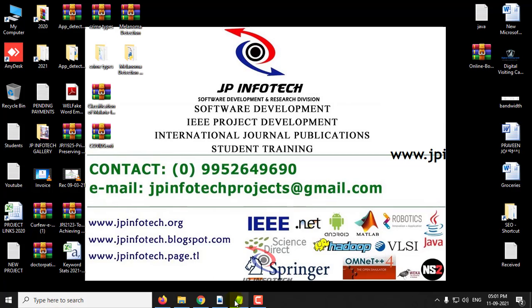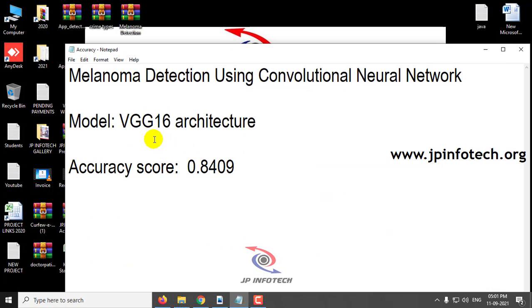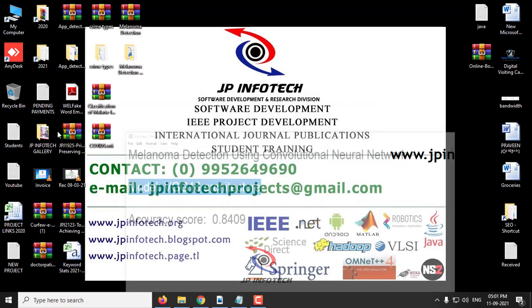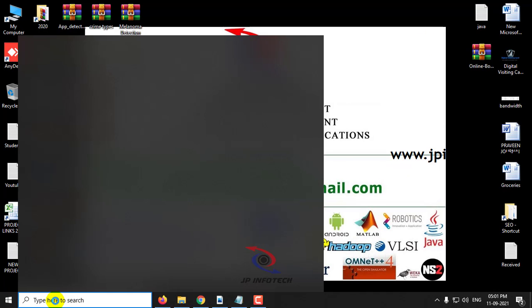We have used VGG-16 architecture for the implementation, and the accuracy score achieved is 0.8409, which is around 84%. Now let us see the execution of the project.